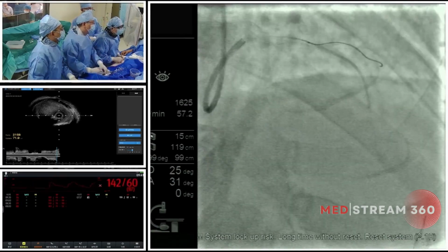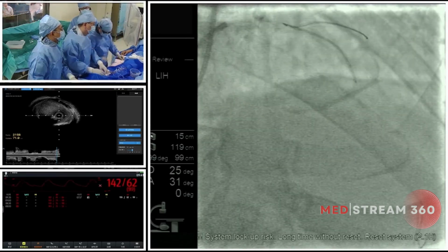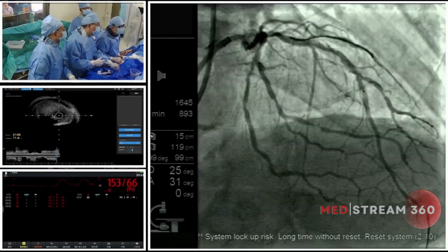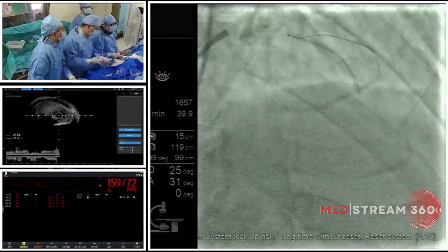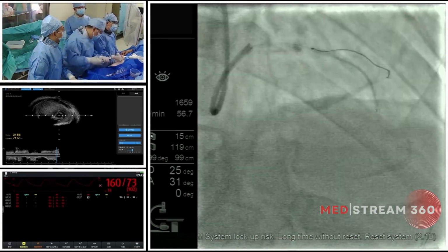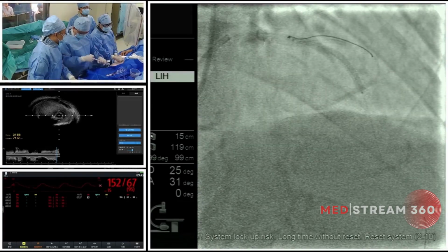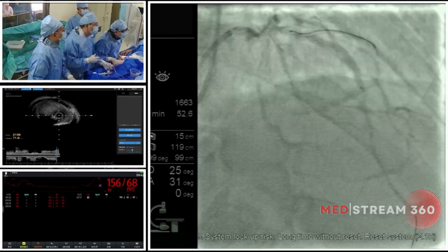Right now we have more weapons to fight against calcification. If we did not have IVL, maybe after rotational atherectomy we could use some balloon-based technologies to treat the lesion. I think it should be fine, but right now we have better techniques. Why not use them, right? That's why you chose the rota and lithotripsy strategy. This is a very good choice.